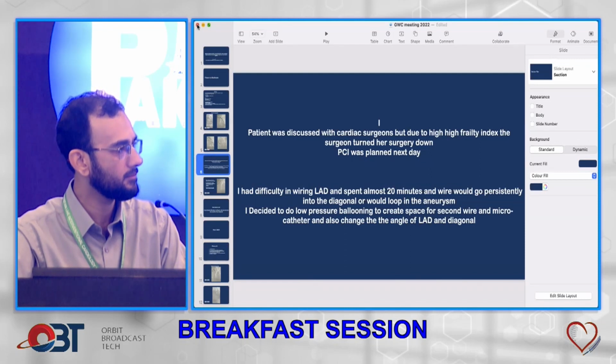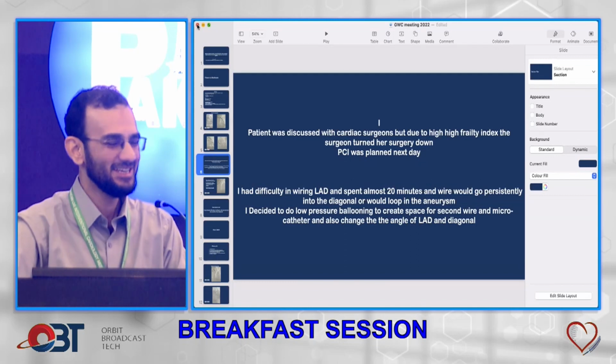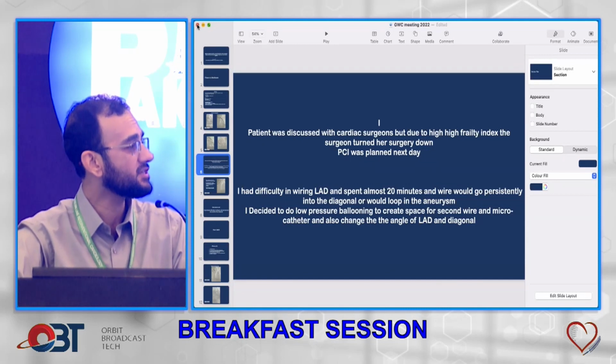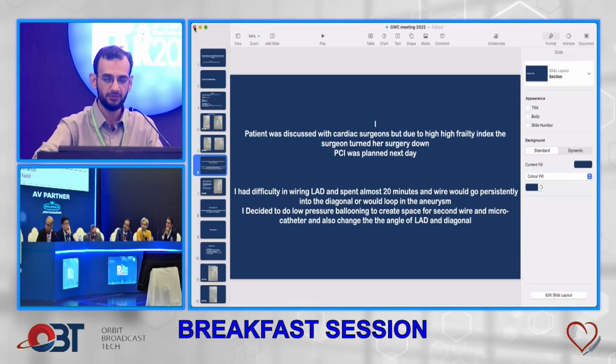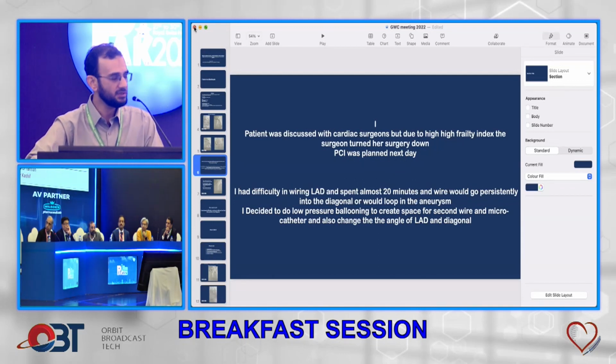After putting the stent, when we saw that ostial thing, I was concerned that there's a large diagonal branch. So let's give it a chance. Now the question was whether we go for a two-stent strategy here, considering such a large diagonal branch, the only sizable diagonal coming off, supplying the anterolateral area, or whether to keep it provisional. We decided to keep it provisional using the modified jailed balloon technique.